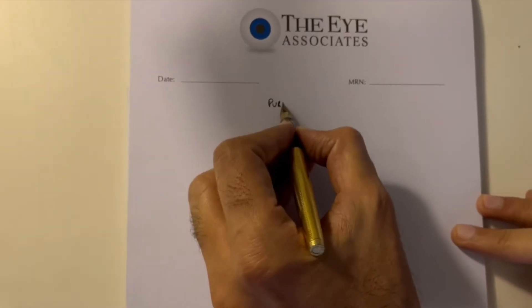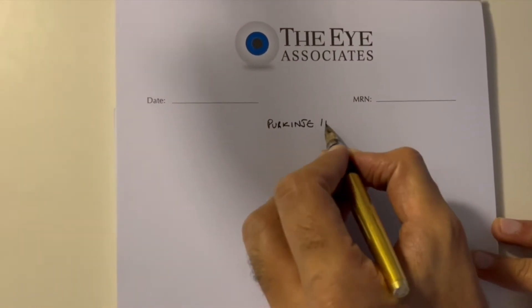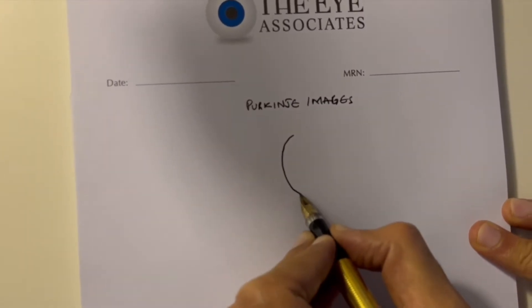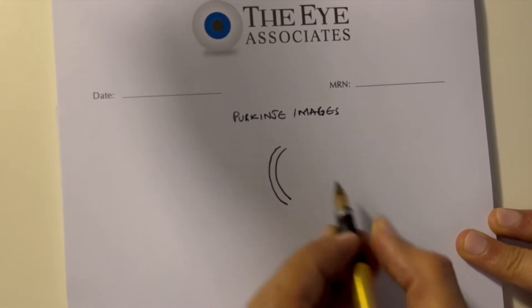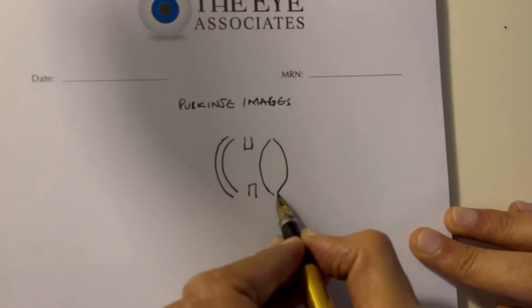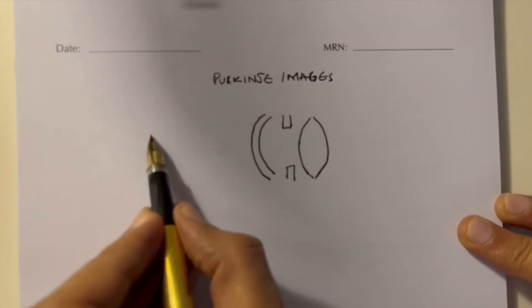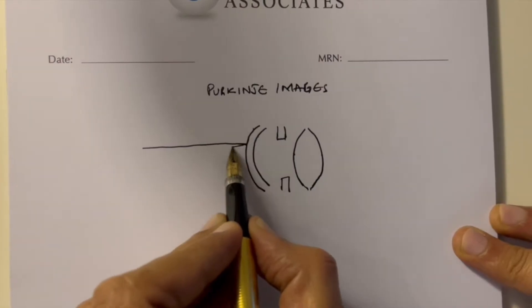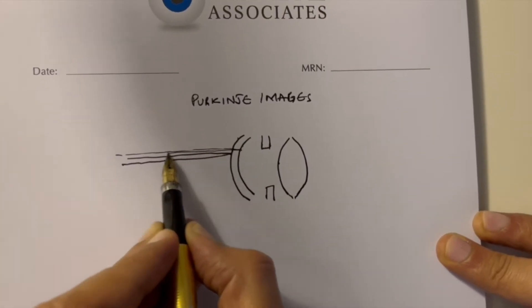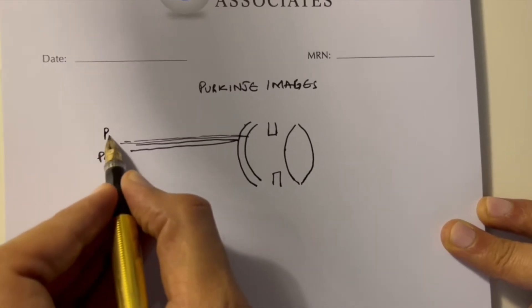This is Elias walking you through the steps of examining the lens and the cornea through Purkinje images. What we basically do is observe reflecting surfaces — you shine an IR light which reflects back and you observe it. The cornea has an anterior surface and a posterior surface, then you have the iris, and then the lens with an anterior surface and a posterior surface. When you shine a light, it reflects back from the anterior surface of the cornea and also from the posterior surface — this is Purkinje image one and Purkinje image two.